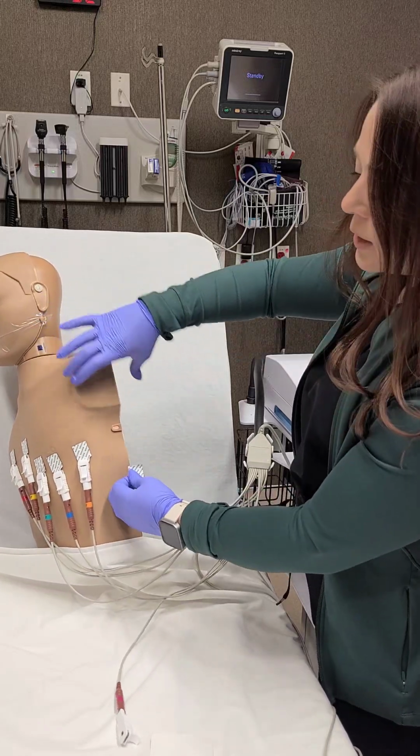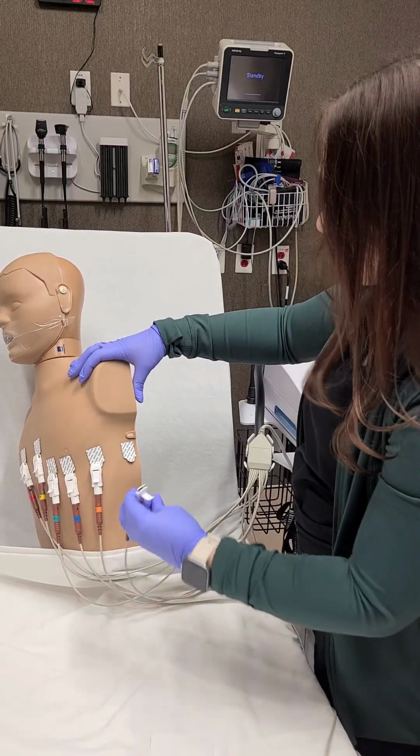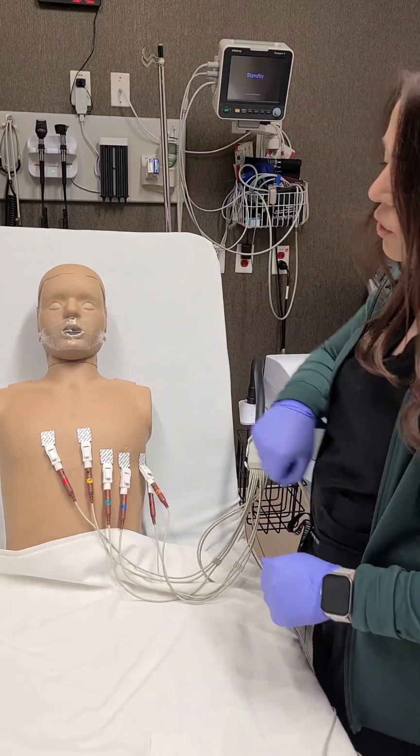If you have your patient's arm here, you will not see V6. They have to move the arm out of the way. But it stays in that same fifth intercostal space there. That's how you do your chest lead.